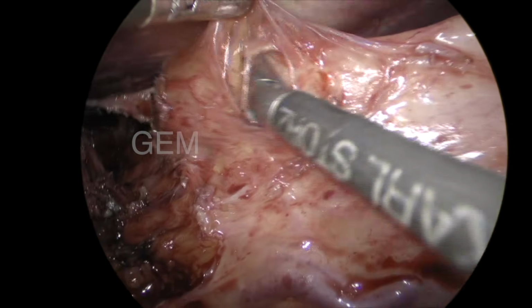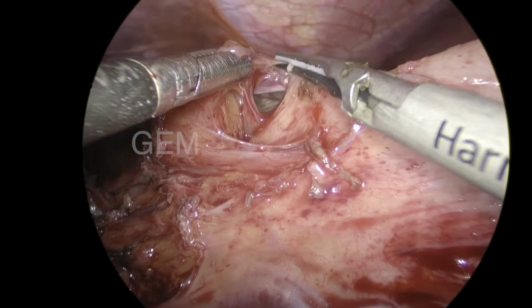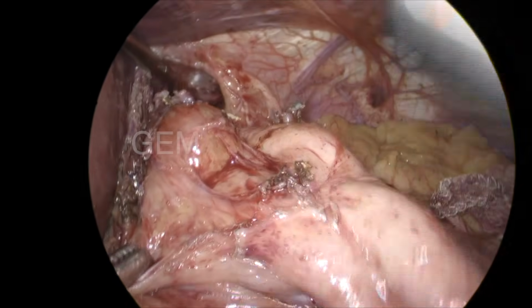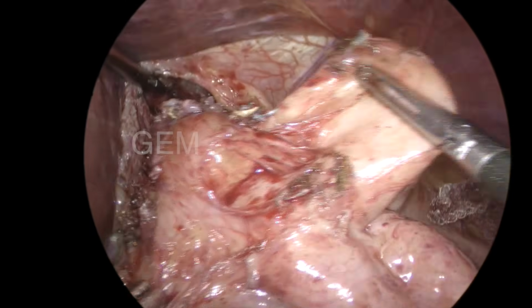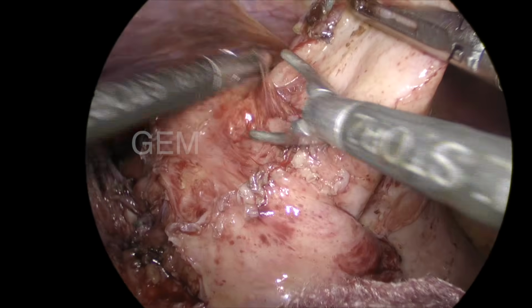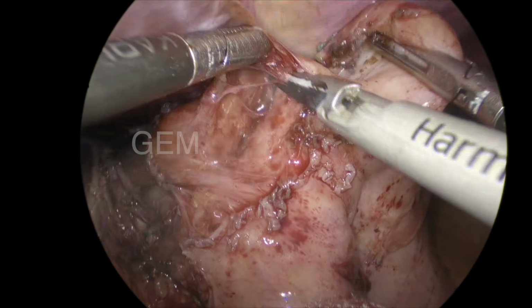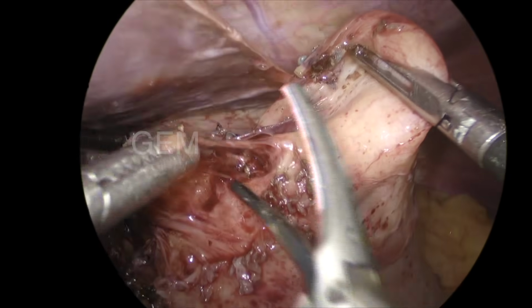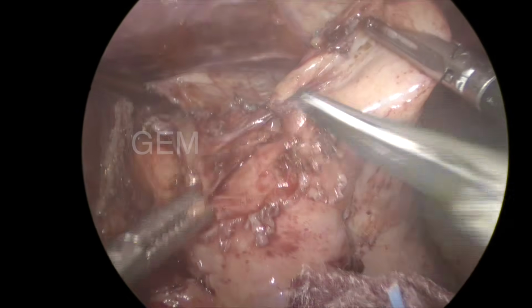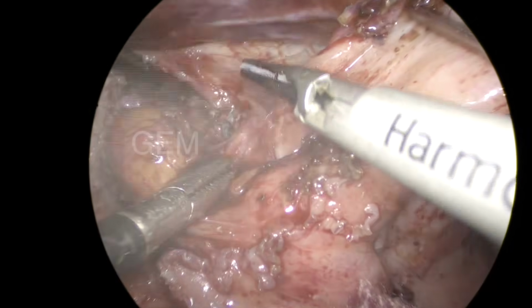You can see, I am dissecting with the Maryland dissector. Identify the structure. If it is a fibrous band-like structure, I am dividing it. That looked like a lymph node. Again, I am not trying to take out the node. My aim is to straighten the fundus. All the attachments, the sutures, are to be removed, and then the fundal wrap is to be disrupted completely. Then I can go for a myotomy.